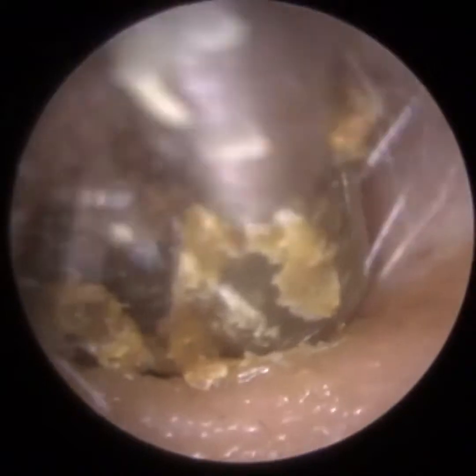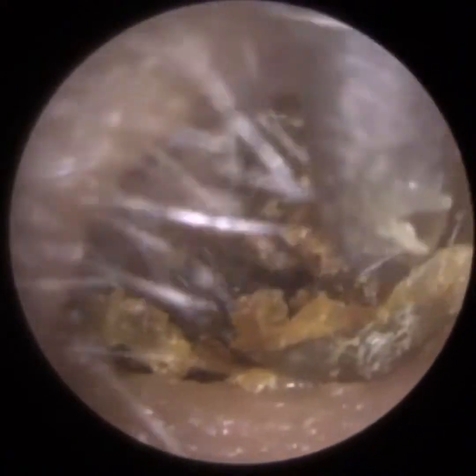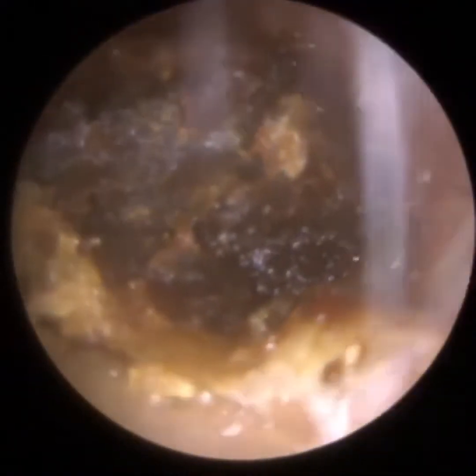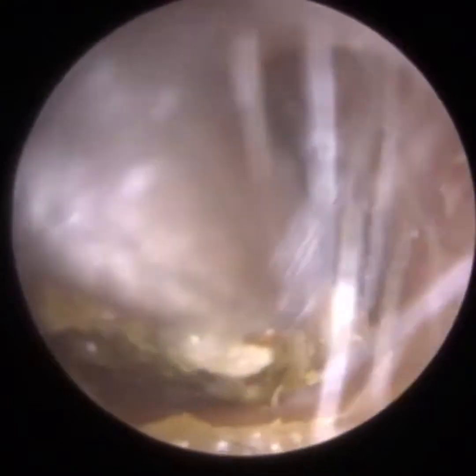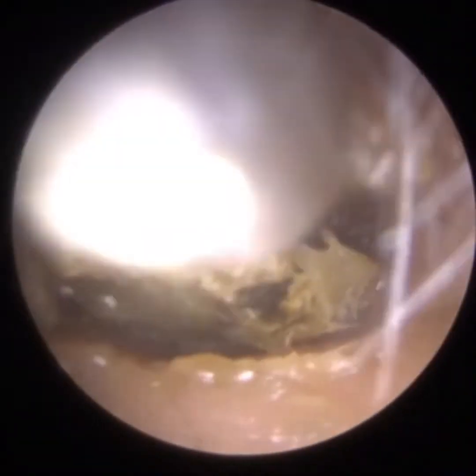Now this is a huge piece of wax that was stuck in the patient's ear, and when I pulled this plug out, it separated into two. You'll see once I got this out, I was hoping it would all come out in one piece, but it didn't. You can see there's another plug there, which is past the second bend. It's quite deep, and again, the patient's very anxious. Just talking the patient through, advising them that although the wax is deep, there's a bit at the entrance that I can suction onto to pull it out.